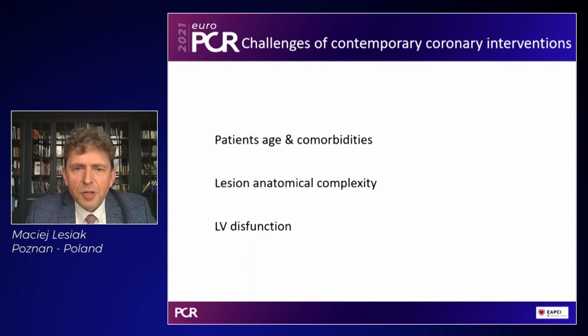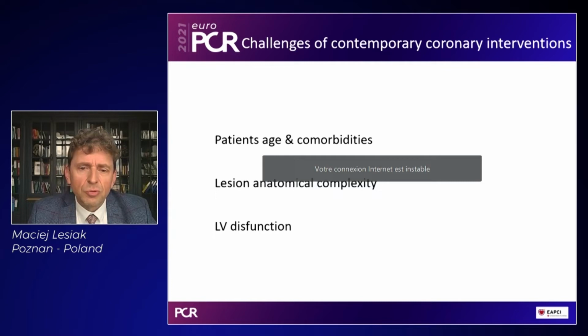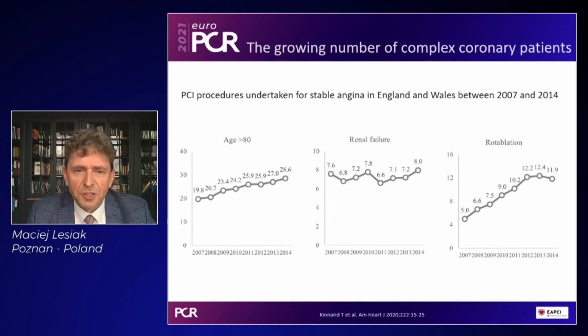So we all know what the challenges of contemporary coronary interventions are. We deal with more and more old patients who have a lot of comorbidities. We have more and more complex anatomy to treat. And also we have more and more patients with left ventricle dysfunction.